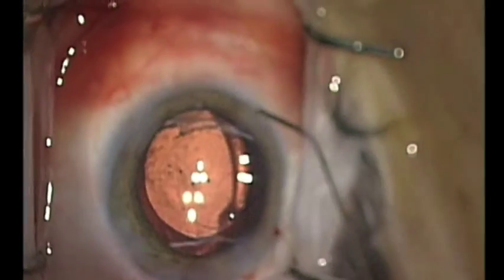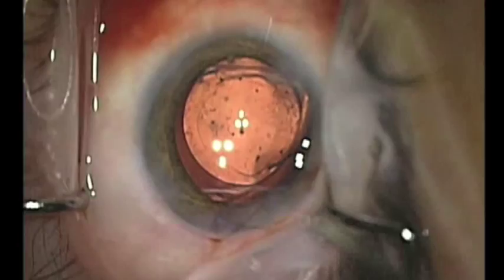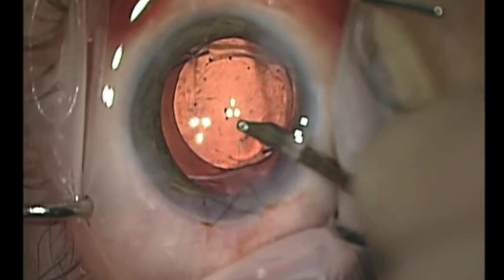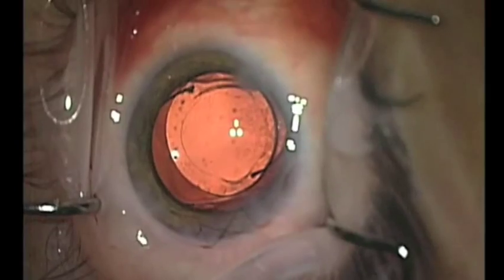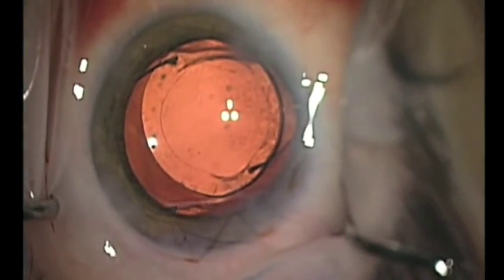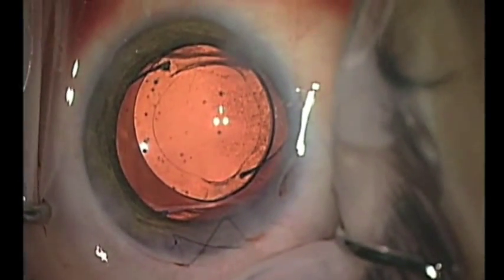Stromal hydration is then carried out for the paracenteses. A single nylon suture is placed in the main incision before removing the viscoelastic from the anterior chamber, the capsular bag, and from behind the intraocular lens. At the end of the case, the lens is nicely positioned into the capsular bag.